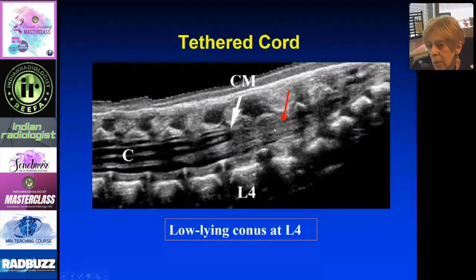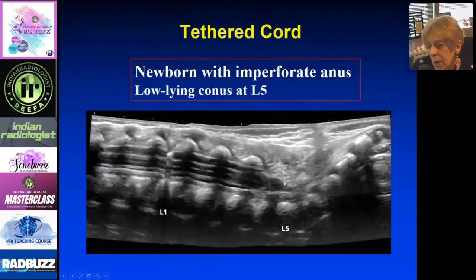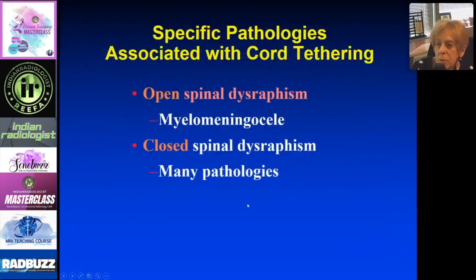Here is another tethered cord in a patient with imperforate anus — the cord is at L5 with a normal shape, but that position is tethered. Specific pathologies that can tether the cord include myelomeningocele, open dysraphism, and closed dysraphism, with many subtypes in each category.